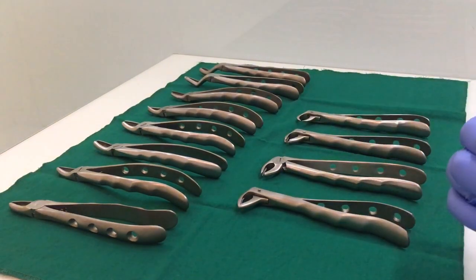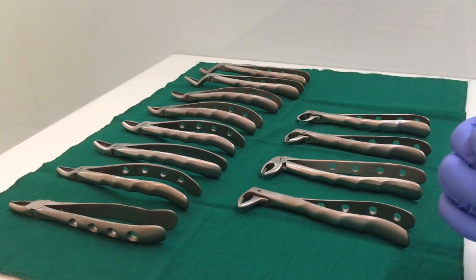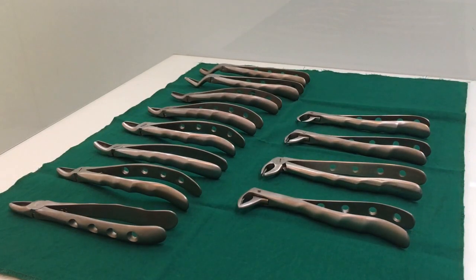So we have learned about the identification of both the upper and lower dental extraction forceps. I hope this video was helpful for you. Thank you.